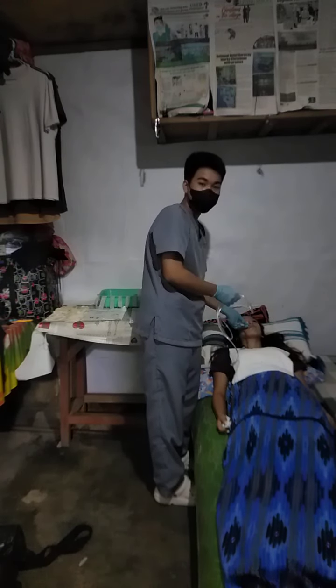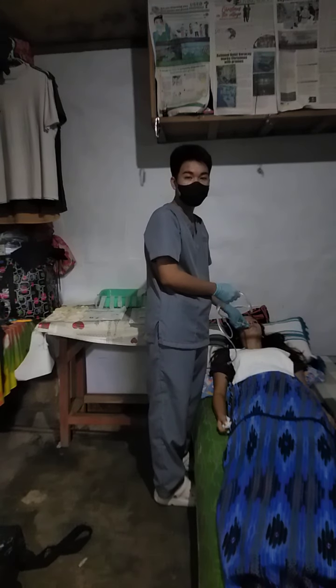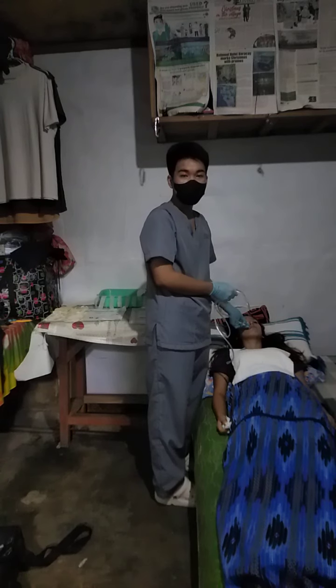Now, when the pharynx is reached, instruct the patient to touch chin to chest, bringing the head forward, which helps close the trachea and open the esophagus. Then encourage the patient to swallow even if no fluids are permitted. So, ma'am. Lunok po. 1, 2, 3, lunok. 1, 2, 3, lunok.